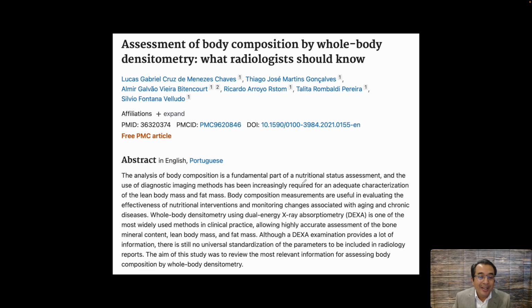This is a good article on assessment of body composition. I personally feel that this is the next step of utilization of a DXA scanner, where we have moved from scanning the patients to diagnose osteopenia, osteoporosis, assessing response to treatment, doing vertebral fracture analysis, and now to body composition imaging. I think in future this will be a more common use of a DXA scanner.